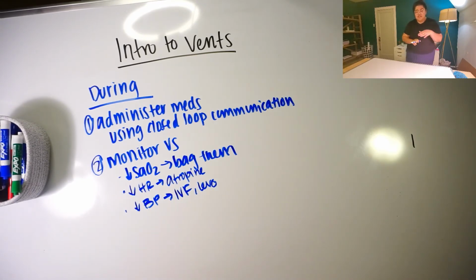So I kind of talked about during before telling you the actual setup. Before you actually start, we're going to get all our supplies. The patient's bed should be pulled away from the wall so the physician can be at the head of the bed. And we're going to lay the patient flat, pull them all the way up in bed. All of our supplies are ready, vents ready, etc. So then this is our job during.